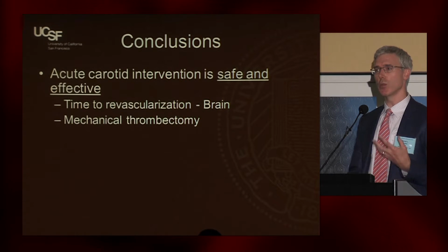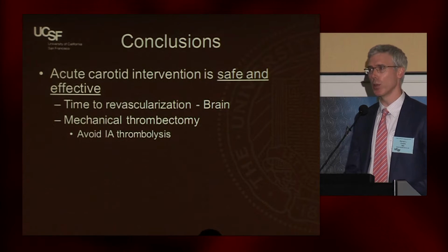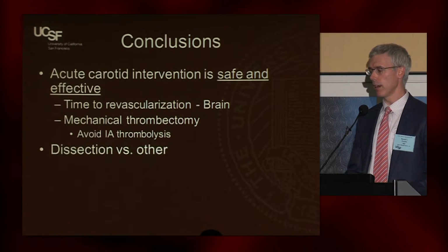Mechanical thrombectomy is really the mainstay of practice now. We try to avoid IA thrombolysis. If you remember back to that slide where two-thirds of those patients were getting it and they had this very high symptomatic bleed rate, we don't have these problems as often as we did in the past.